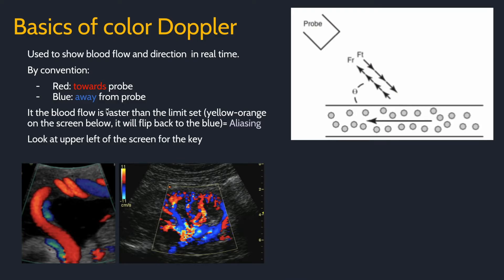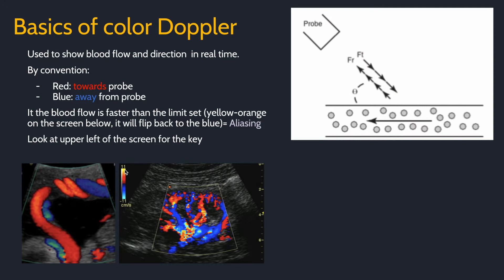Color Doppler is useful for showing blood flow and direction in real time. By convention, red is towards the probe and blue is away from the probe. You can check in the upper left of the screen for the scale and the direction. You should know that if the blood flows faster than the limit set, it will flip back to the beginning. So here, as blood moves away from the probe, it will be blue and then go to white. However, if it goes above 11 centimeters per second here, it will flip back to red. This is called aliasing.